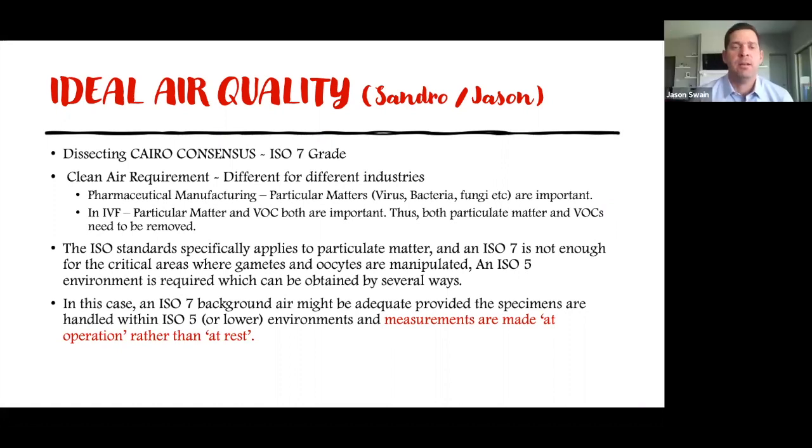Yeah, and as everyone knows, when you write a consensus, if you're too strict, you cause issues, because if a lab isn't up to snuff, so to speak, splitting hairs over ISO 5, ISO 7 can create problems. But 100% agree, VOCs are as important, if not more important, than particle count. And I believe, as I recall, David Mortimer and others who are associated with this, the ISO 7 was still strict. It deals with particle number.